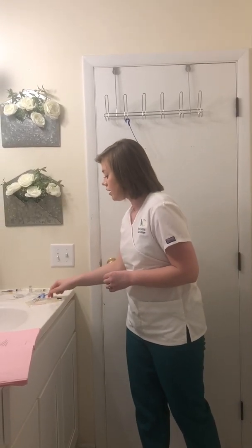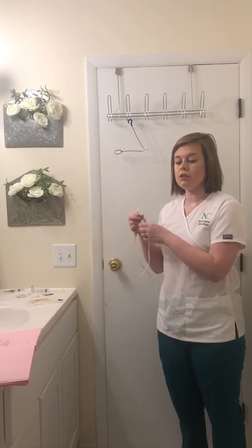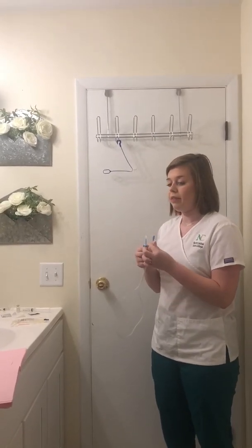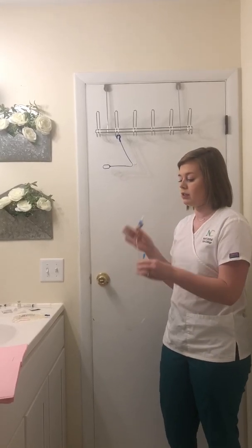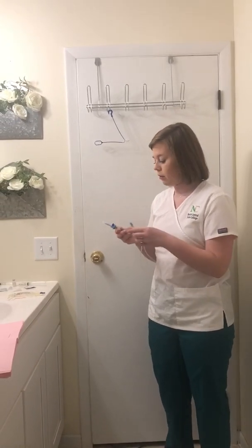and then I would connect my secondary tubing to that port, and then I would back prime it with the normal saline, and I would just lower that secondary bag, just make sure it's getting through there, and then I would fill my chamber up halfway or a third of the way full.